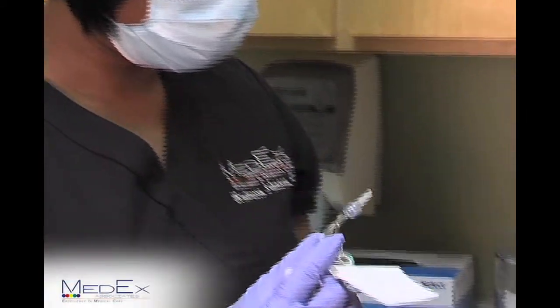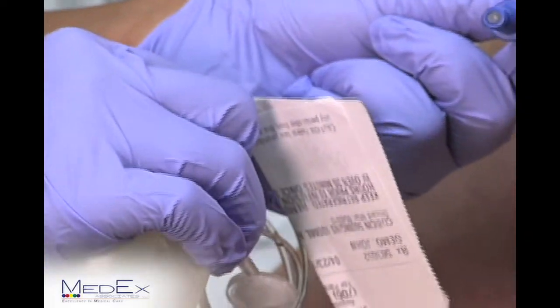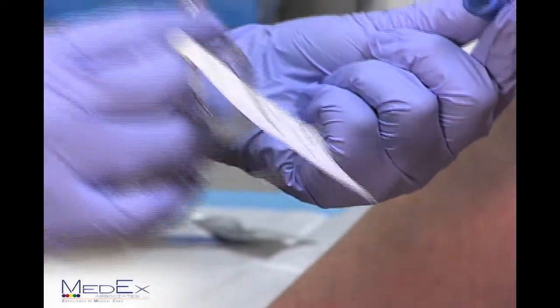Now you're ready to hook up your antibiotic. To do so, you begin by removing the wing cap on the end. Your cap will twist off and you can discard it in the trash.